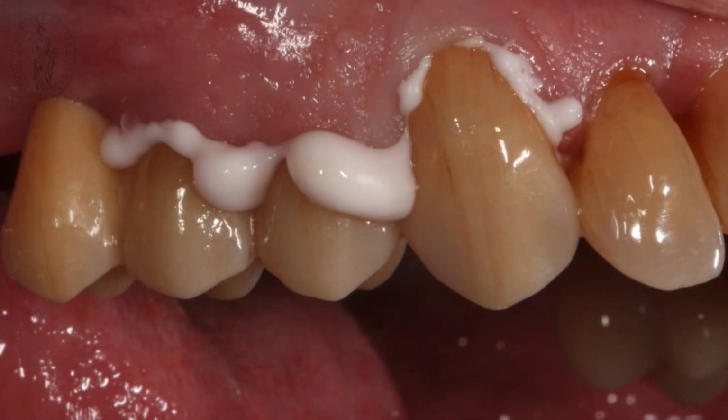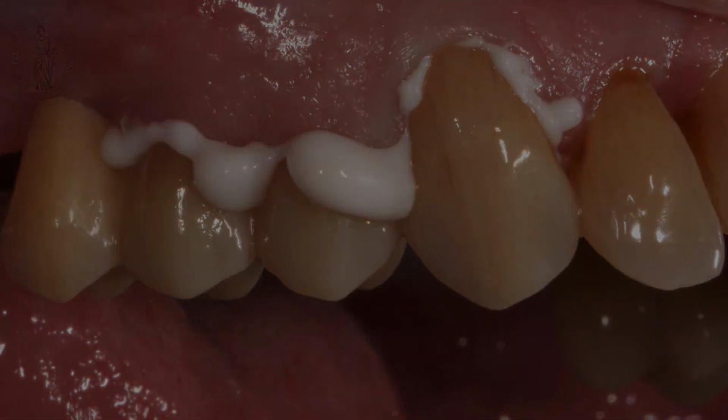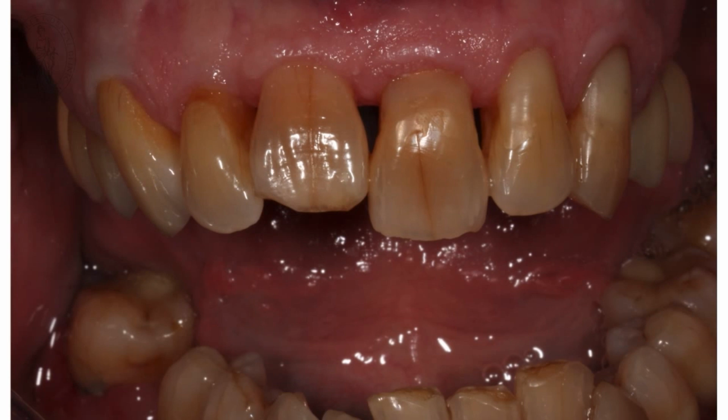And then after cleaning the teeth and after cleaning the bridge again, the bridge is cemented in. You can see the white stuff coming out, that's the cement. We clean that and you can see the bridge is gone. You can't see anything anymore. Very colorful teeth, not very beautiful teeth, but our bridge blends in perfectly to that. You don't see that we have been there.